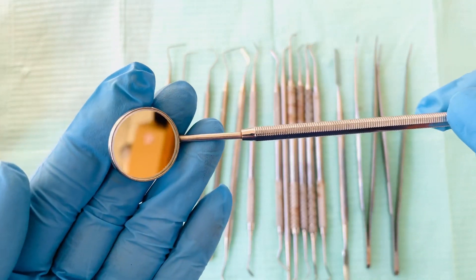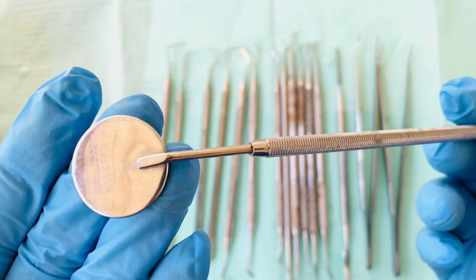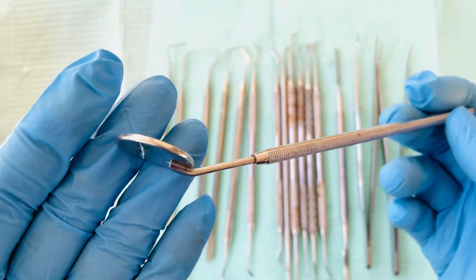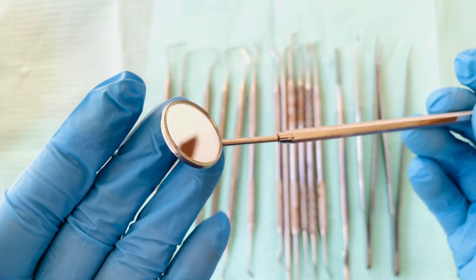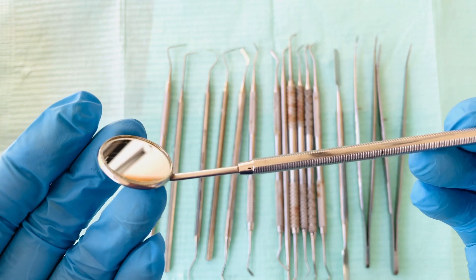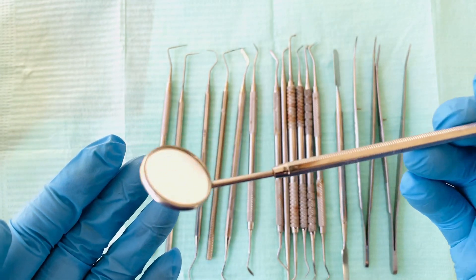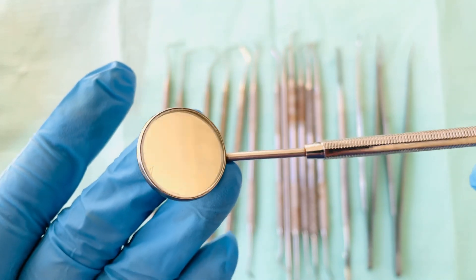Let's start with the mouth mirror. The mouth mirror is used for indirect vision during a dental examination — it's used to see the inside part of the mouth. It's also used to trans-illuminate or to reflect light inside the mouth when the clinician is doing a check.